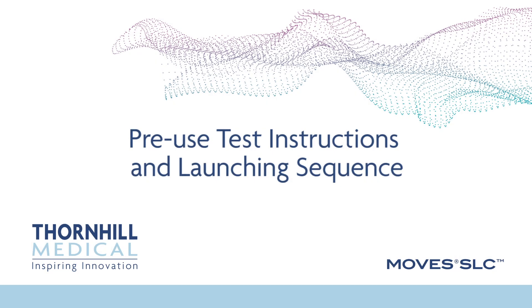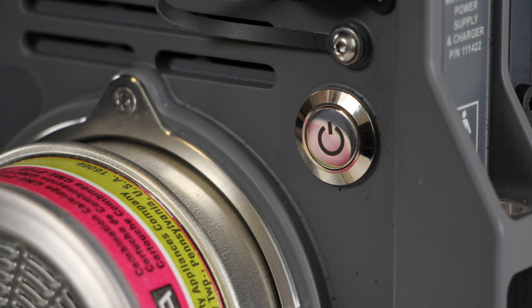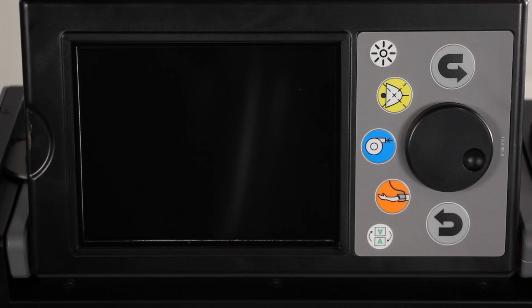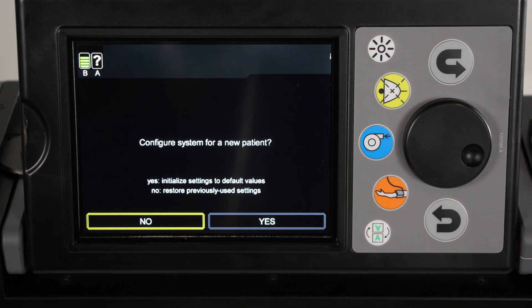Pre-use test instructions and launching sequence. Locate the power control button on the rear of the MOVES SLC unit and press it to activate the unit. An audible alert is sounded, and if the system has been run within the last 30 minutes, the new patient screen will be displayed asking if the operator would like to configure the system for a new patient. If yes is selected, all system settings including alarms and limits are reset to their default values. If no is selected, all system settings including alarms and limits are retained from previous use. Select no if the system is connected to the patient on whom it was last used and you want to keep all the previous settings.